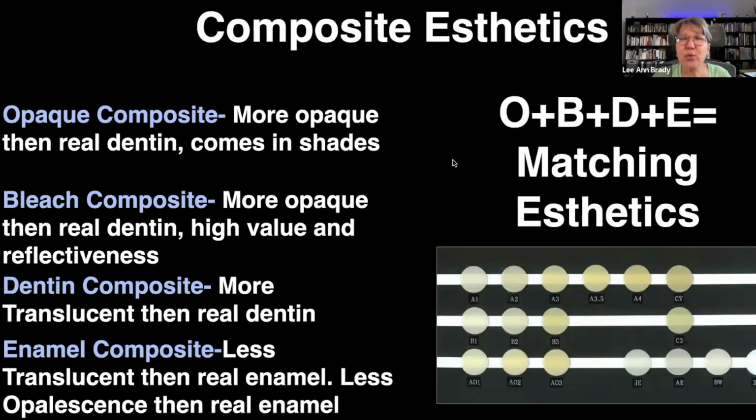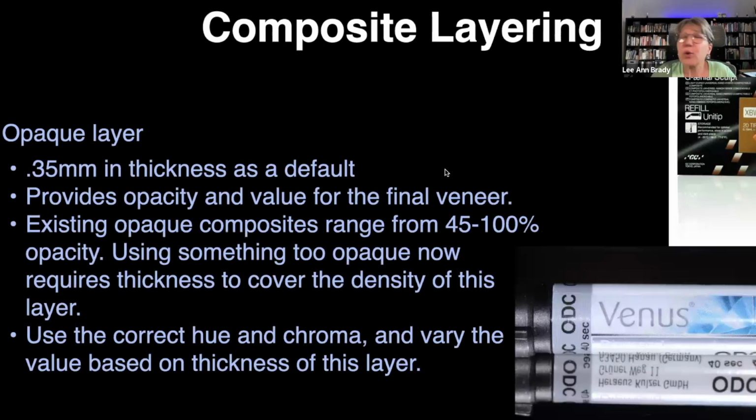And you have to vary the thickness of these layers to actually replicate the natural tooth structure. So you've got to have all of these available, and then you've got to sit and figure out your recipe. And that's actually what I was doing in that slide before I ever started to prep the tooth. Right. So the most lingual layer of the tooth.